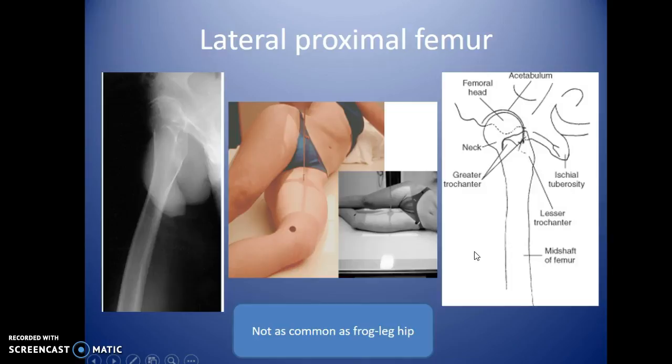The lateral proximal femur is one way to image this area, though it's not the typical method. It's not as common as the frog leg hip view, which we'll show in a moment. This approach works if your patient can roll into almost a lateral position while keeping their knees still on the table.